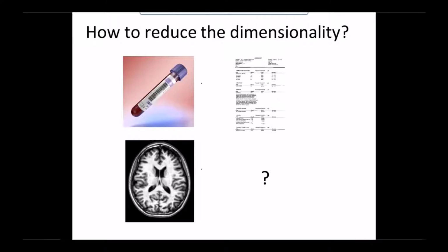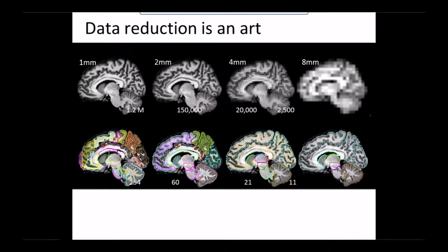And so we do that by essentially using the ontology, or the language that radiologists use, at the scale of 1 millimeter to represent the brain, and that's called an ontology. There are about 400 structures in the brain that are seeable in MRI and that people understand or track, and that's going to be the key to it.